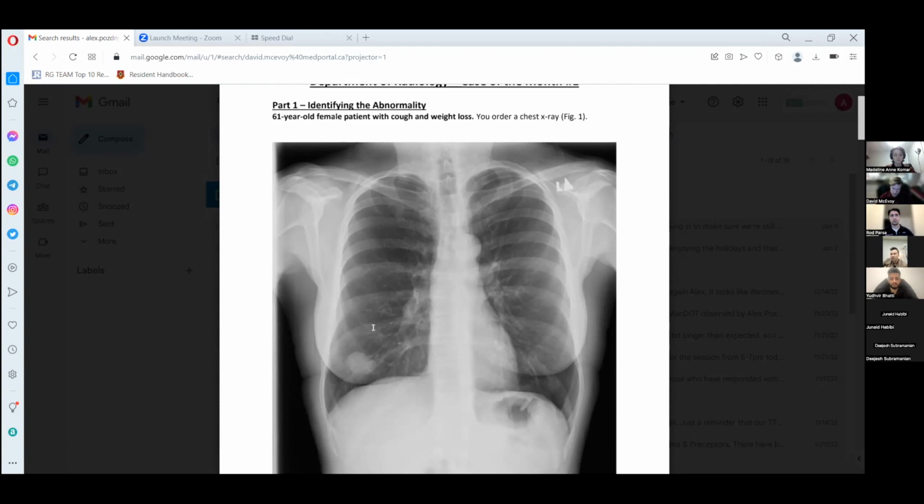So another important thing to note, and that applies a little bit more to CTs, which are essentially just 3D radiographs. They use the same physics principle. It's just X-rays coming from different angles and creating more of a 3D image that you cut into three different planes and can examine. So if you think about the density of fat versus water, which one is more dense? Fat versus a simple fluid like water or blood? Does anyone know?